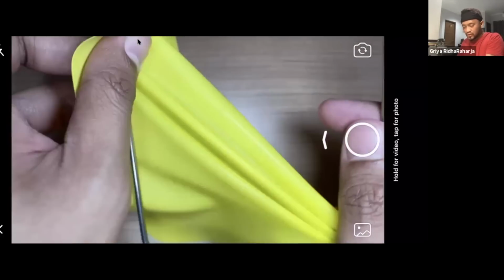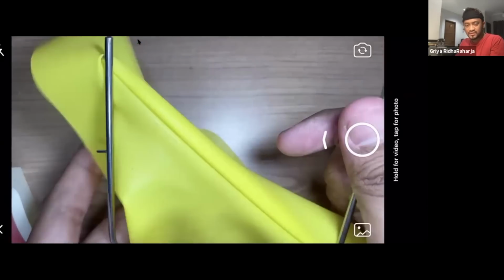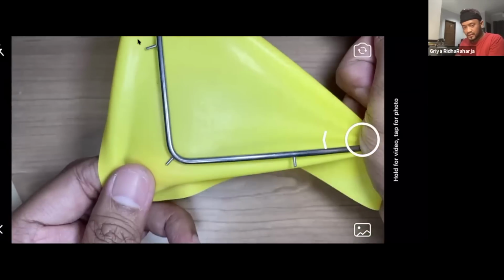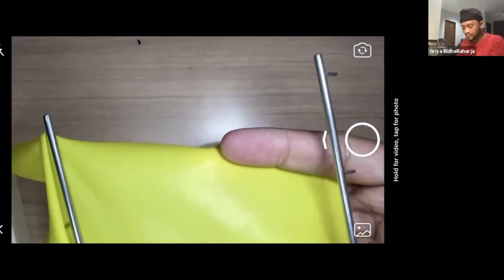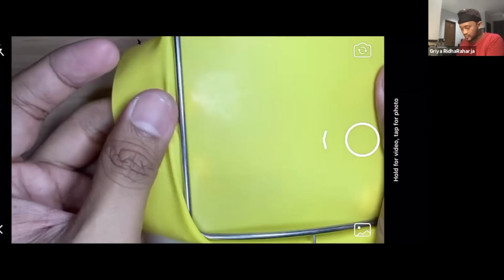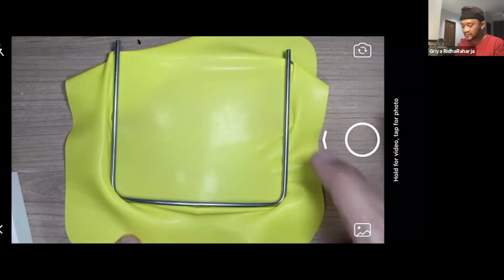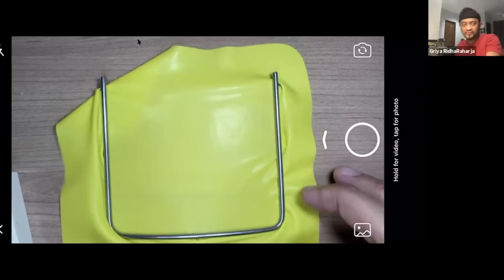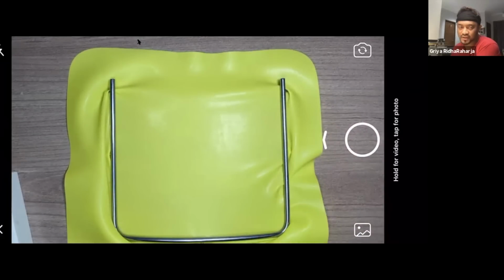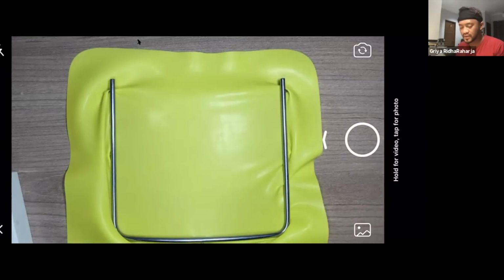Okay, so if you already have a nice tension in here, it will stick like this. So just pull again and then release. Pull and off, pull and off. You have 7 points: 1, 2, 3, 4, 5, 6, 7. My frame is 5 inch. I think that's universal. If you have a bigger one, maybe 6 inch, it's okay. It's not a big problem.